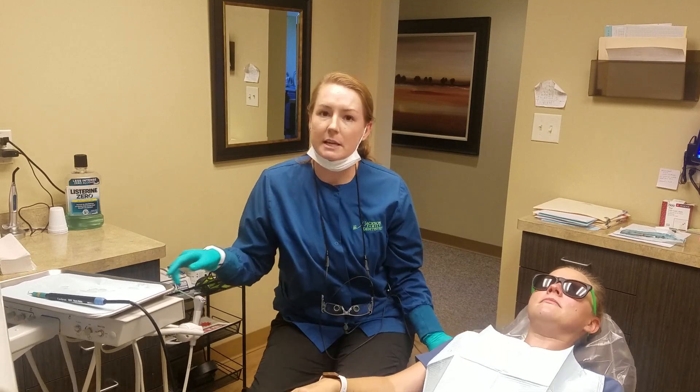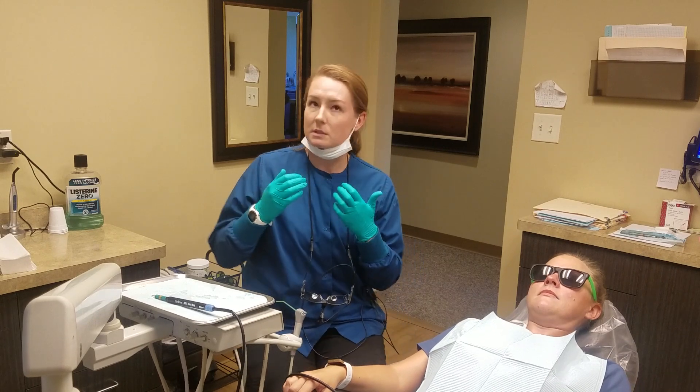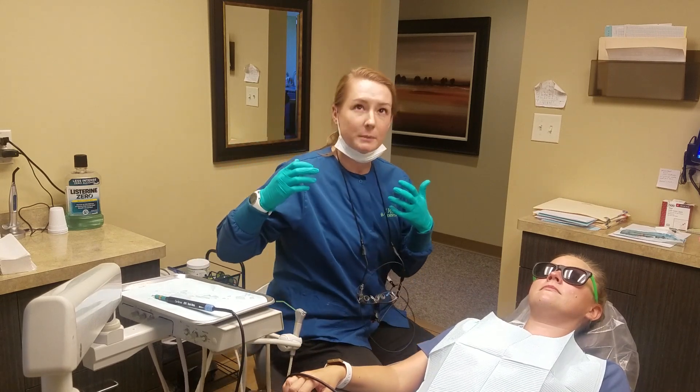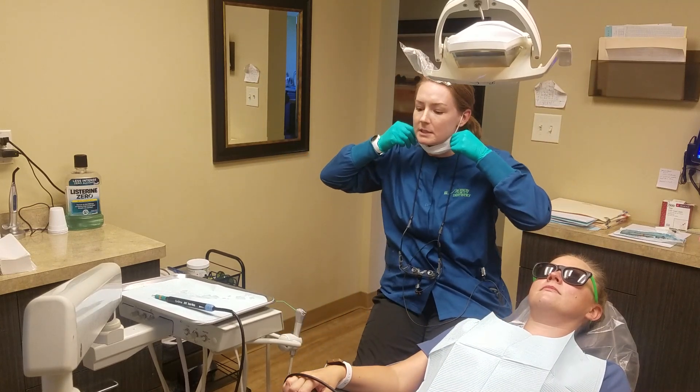A lot of patients like this a lot more just because it's not the scraping feeling on your teeth. There is water that's squirting out, it vibrates a little bit, and it makes a little bit of a noise, but it's not making that scraping noise along your teeth, which is nice.